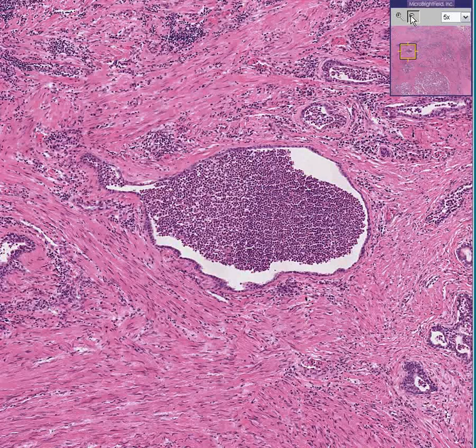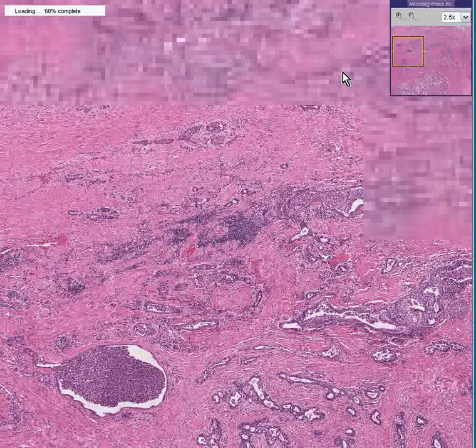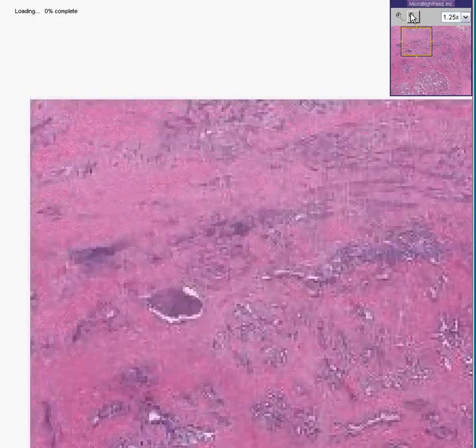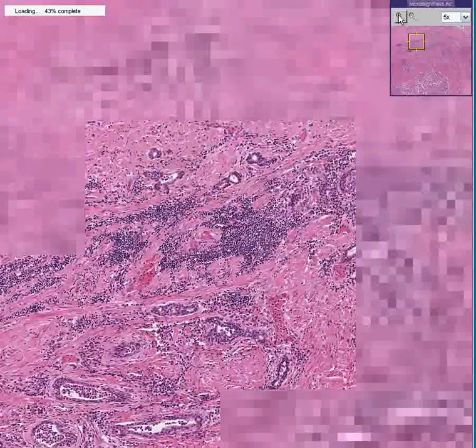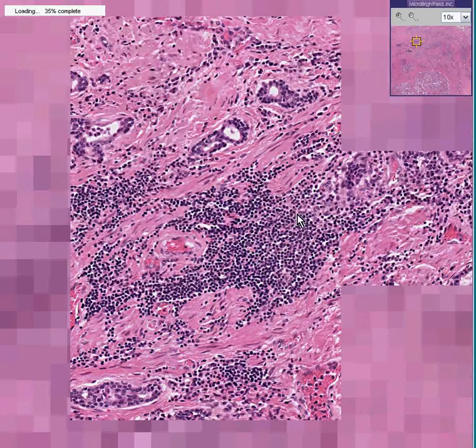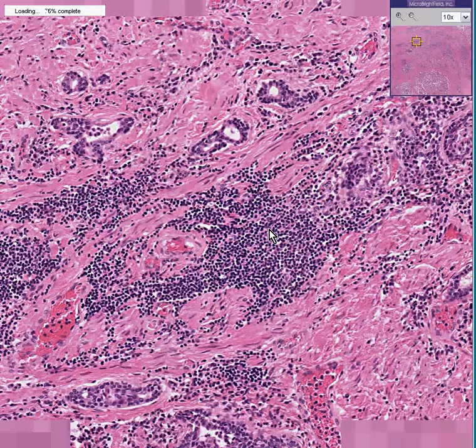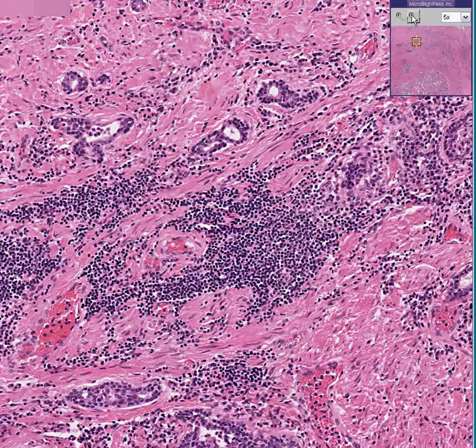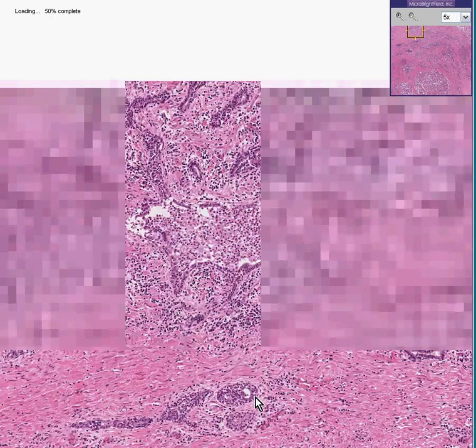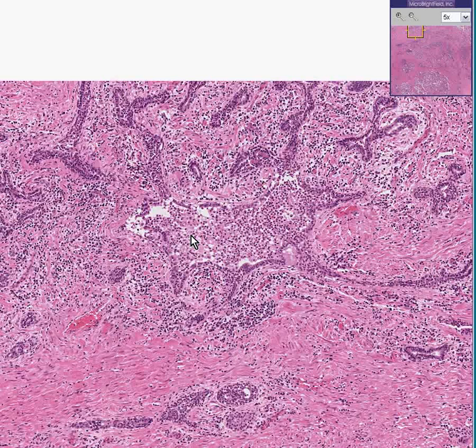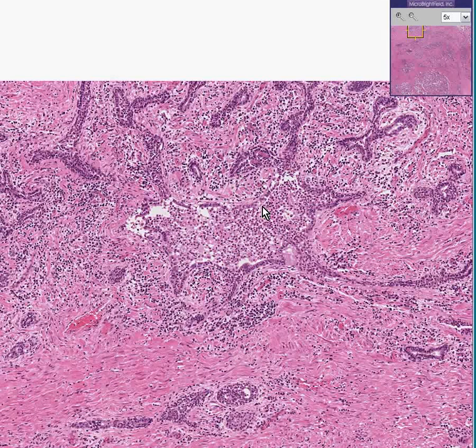This is acute prostatitis. If you wanted to add the term chronic as well, because you see that some of these inflammatory cells are lymphocytes especially in the stroma, you could say acute and chronic prostatitis. But if you believe the main process is acute inflammatory cells destroying the integrity of these glands and surrounding them, rather than a few scattered lymphocytes, I would prefer to just say acute prostatitis.